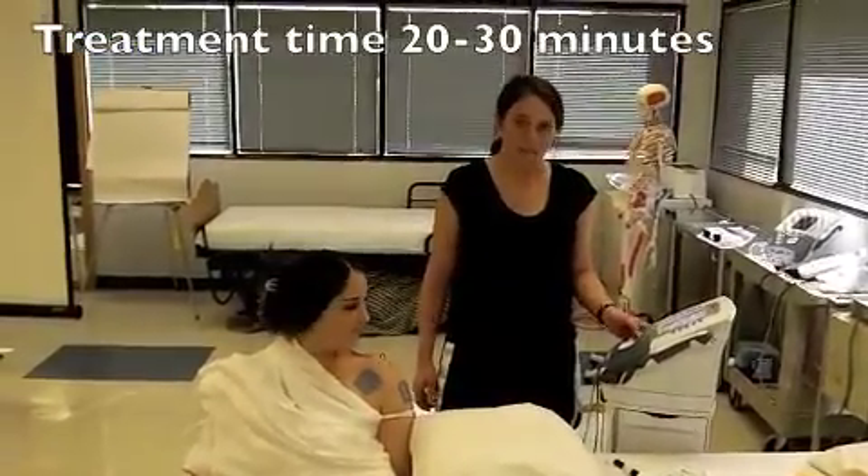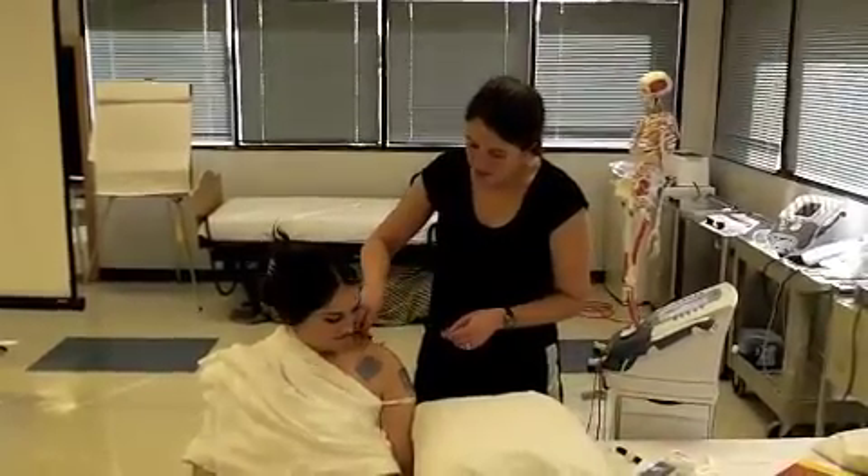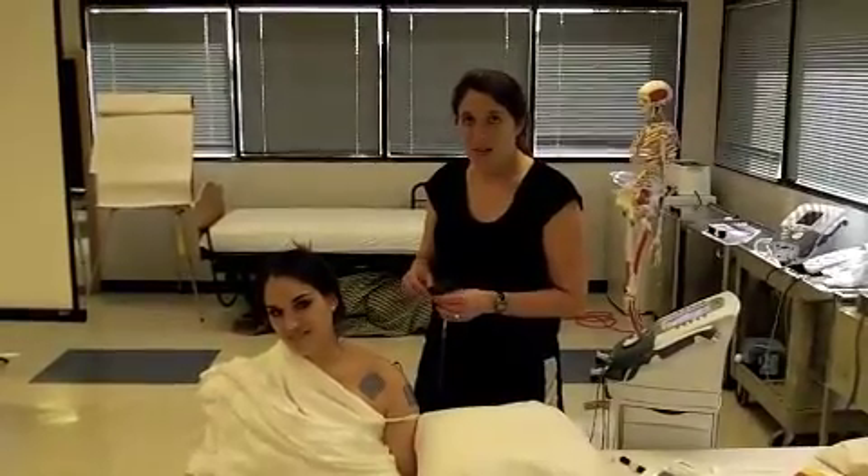We just finished 20 minutes, and now we're going to take off the e-stim. How's your pain feeling? Much better. Excellent. Interferential works.